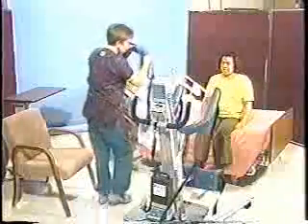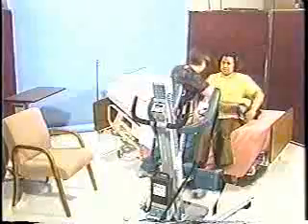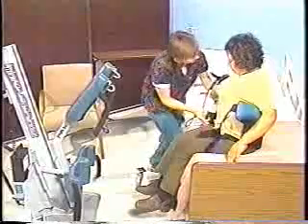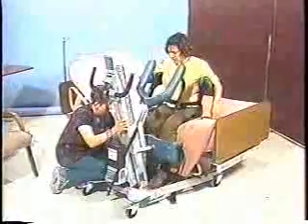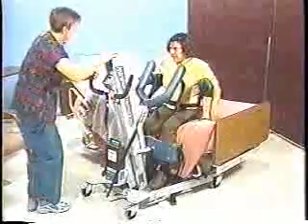Remove the sling from the Y-beam and place it around the patient. Buckle the security strap snugly. Assist the patient's feet onto the footboard. Maneuver the lift against the shins of the legs.